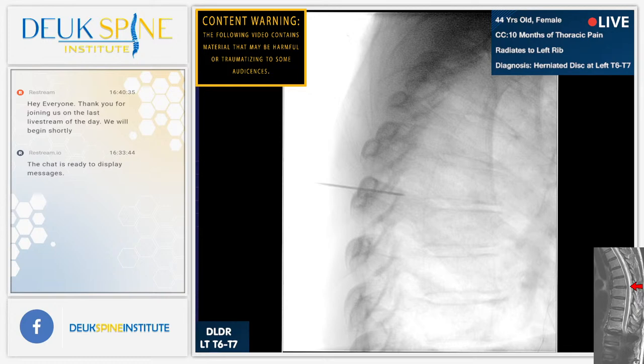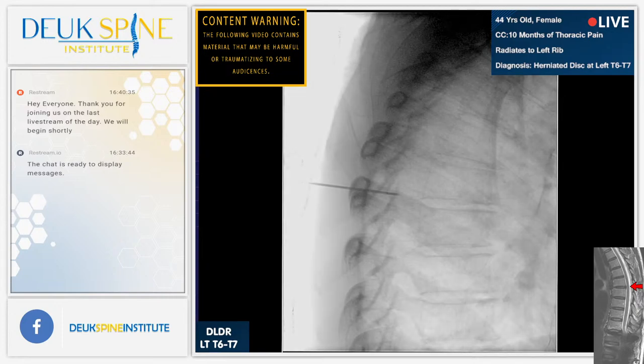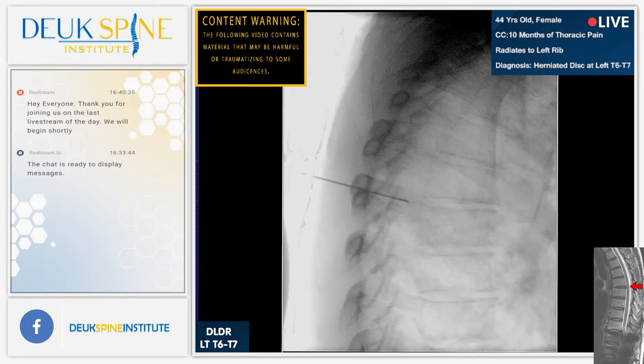That's not bad. Still off on orbit. I think you made it worse. Let's try the other way, maybe. That's better. That's really good right there. All right. So I've got to get down to that T6-7 disc. We're a bit overexposed. Nice. Actually, it's feeling pretty good.